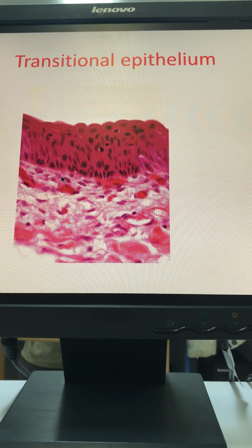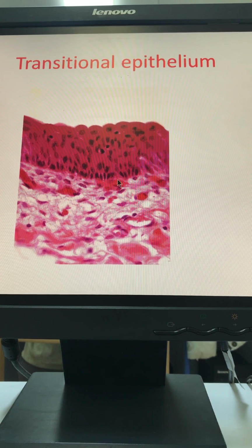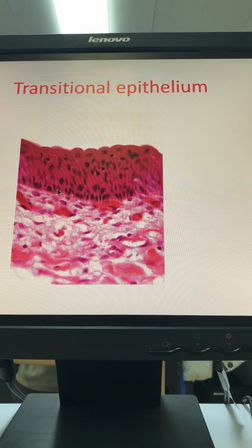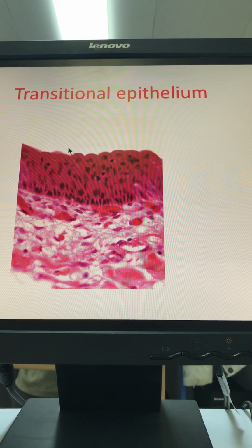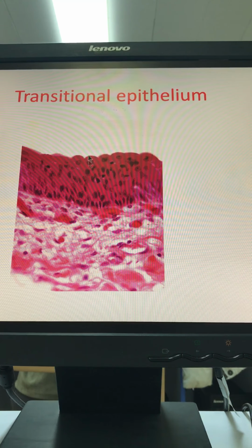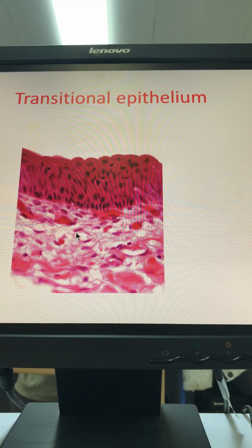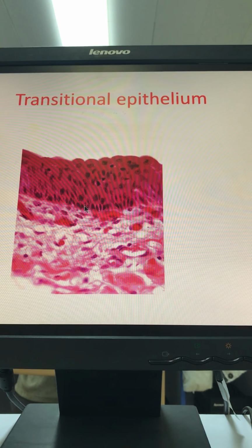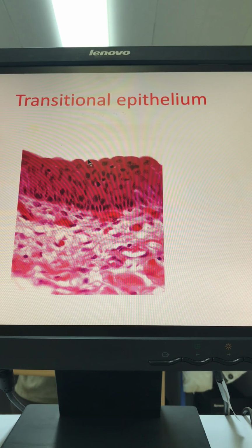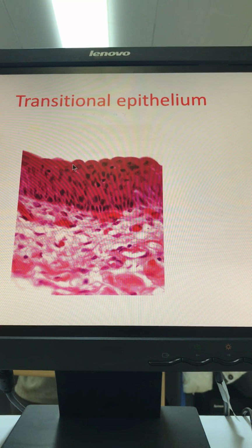Now the next tissue is always connective tissue. بيعمل له support حكينا mechanical support. حكينا إيش بعطيه كمان nourishment. We have no blood capillaries أو vessels within the epithelium. No blood capillaries here. It's avascular. باخذ nourishment من وين؟ من connective tissue underlying. Okay. طيب حكينا إحنا innervated ولا لا الepithelium؟ It is innervated. Epithelium is an innervated tissue.